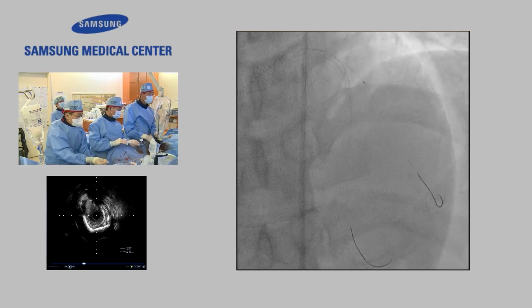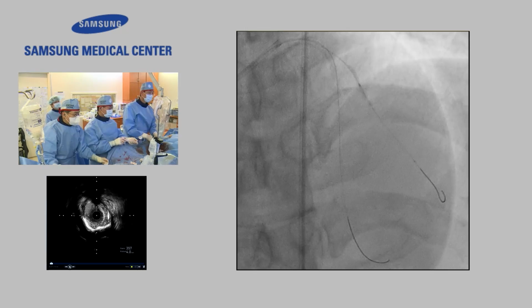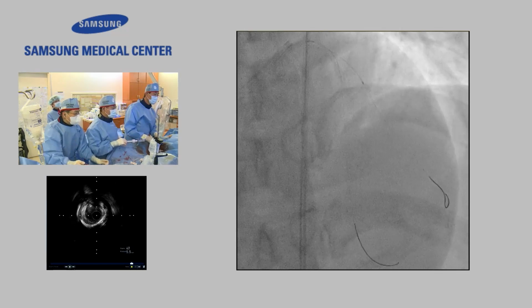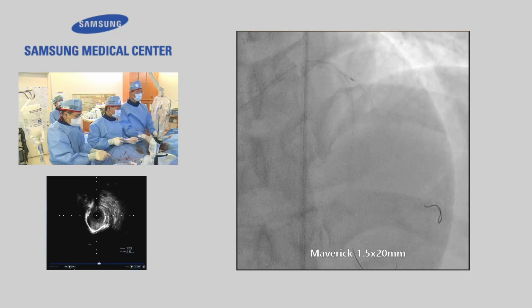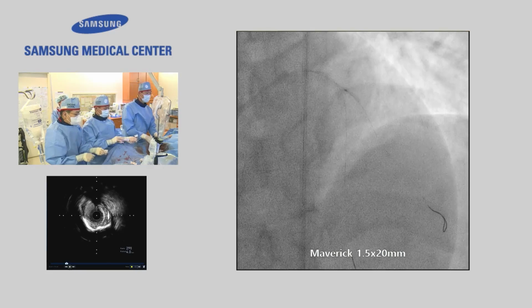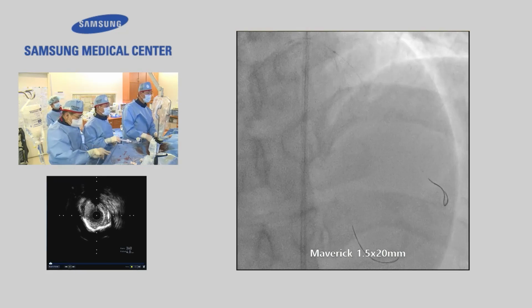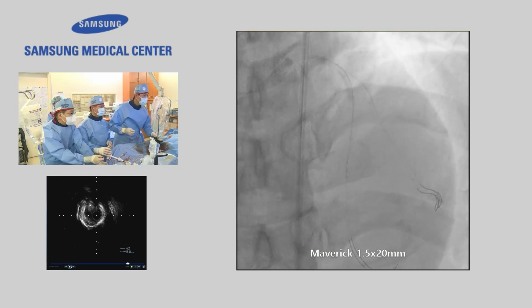Inflation. Any comment from the panel about the strategy, two stents or one stent with DCB? I think evaluation of the diagonal branch by IVUS would be essential to decide the stent strategy.